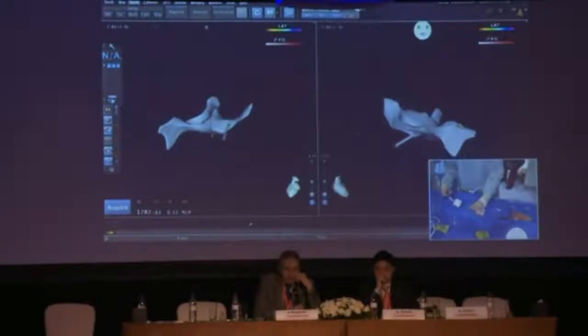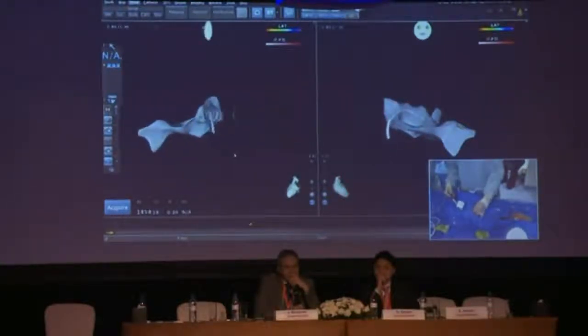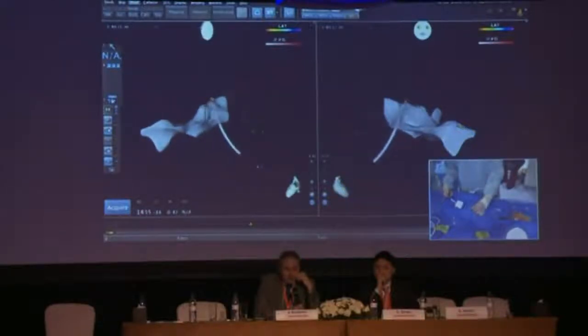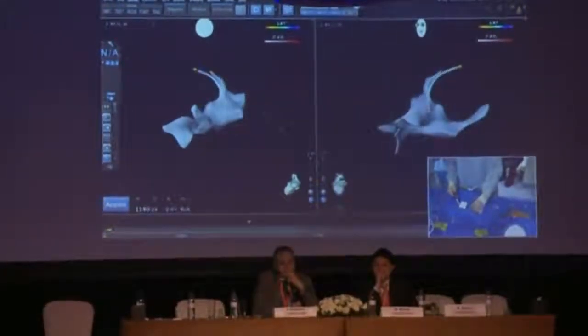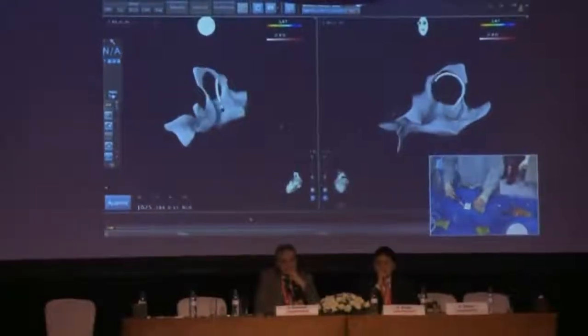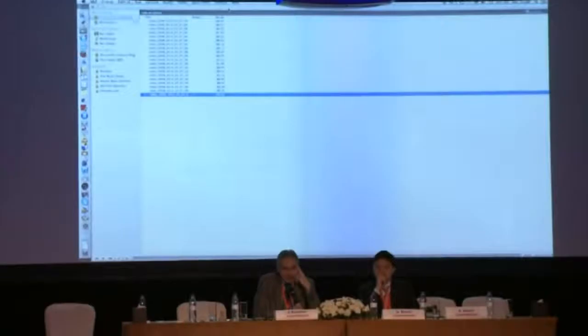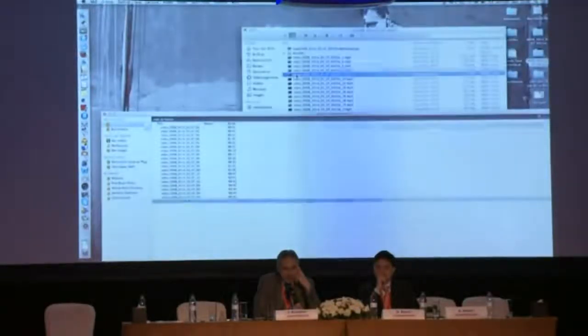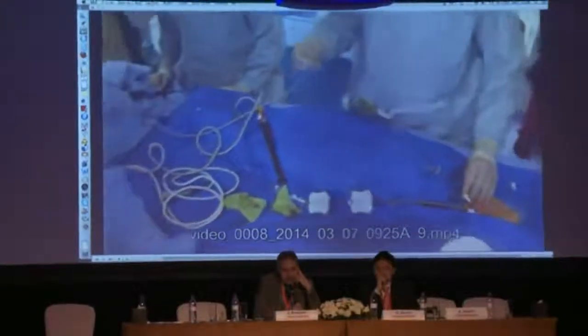Now I'm using the anatomical markers of the CS and the His, so I'm not using X-ray, but I'm also looking for knock on the mapping catheter where it's touching the metal of the transeptal needle, which, remember, is blunt. I've got the sharp bit inside. And here I am sliding it through, alongside the transeptal needle, so that I am through the intraatrial septum and into the left atrium. So that was the LAO view. So we've now crossed the septum with both our needle and our ablation catheter.